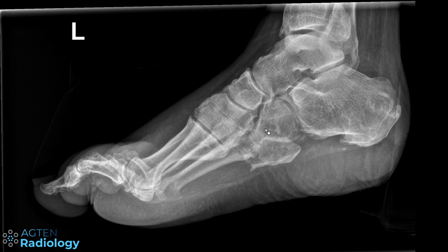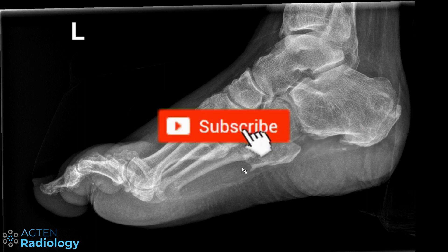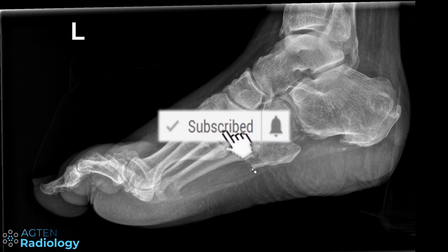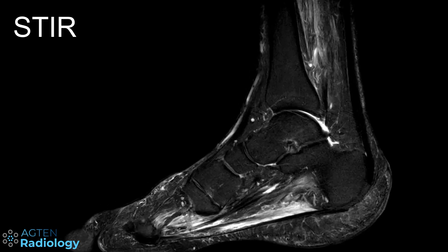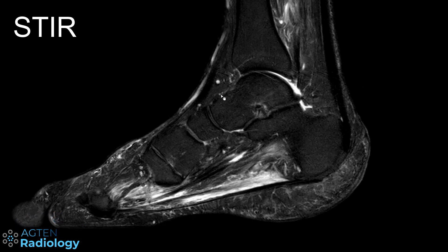This is the same case I showed earlier — it's a diabetes patient who already had an amputation in the past. The reason they did the MR scan was to rule out abscess and osteomyelitis, because he has persisting wound defects at the level of the heel and lateral midfoot.